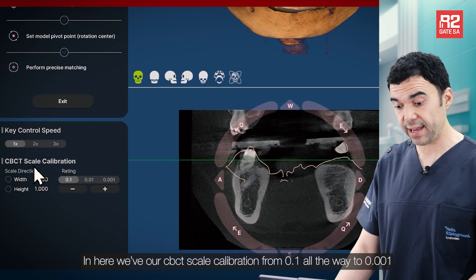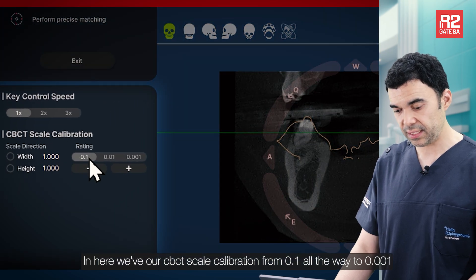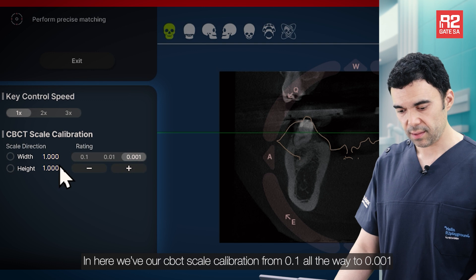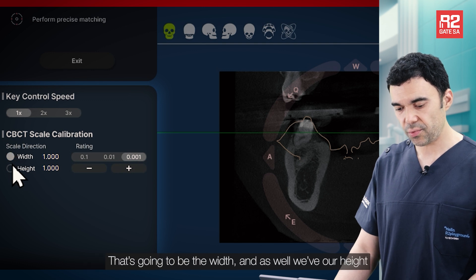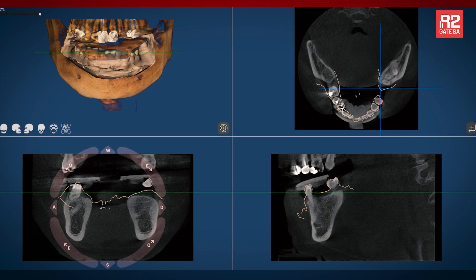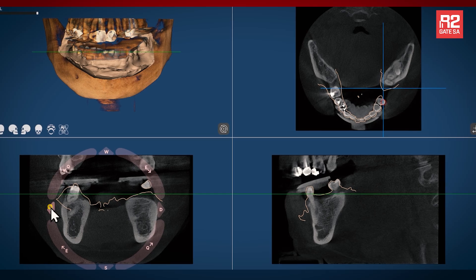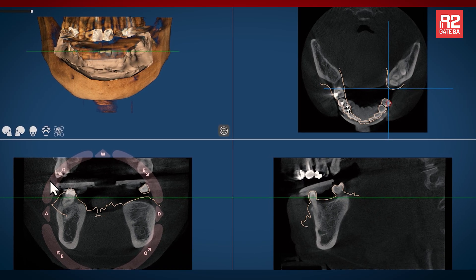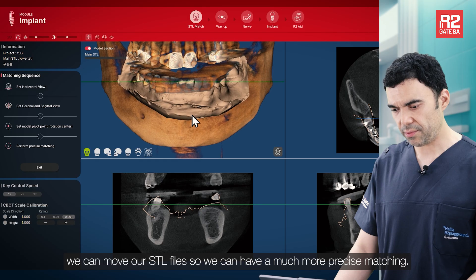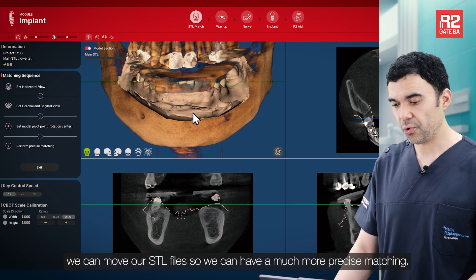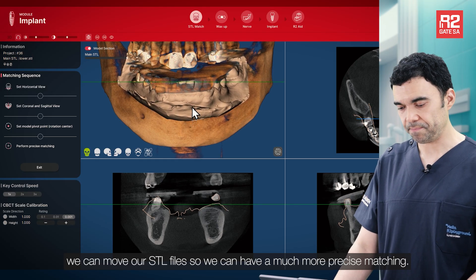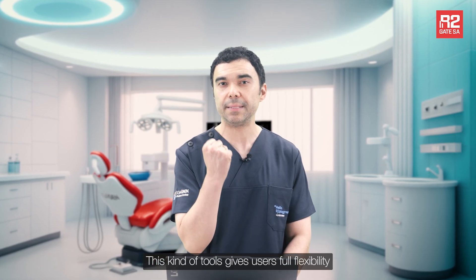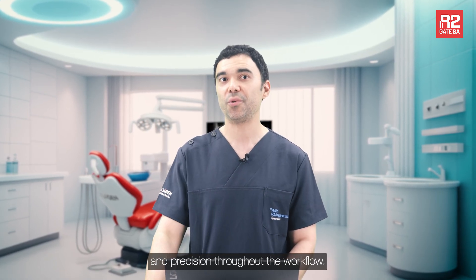In here we have our CBCT scale calibration from 0.1 all the way to 0.001 — that's going to be the width — and as well we have our height. We can move our STL files so we can have a much more precise matching. This kind of tool gives users full flexibility and precision throughout the workflow.